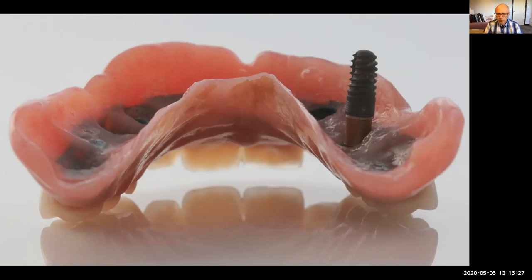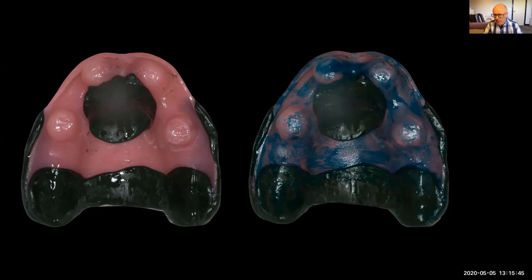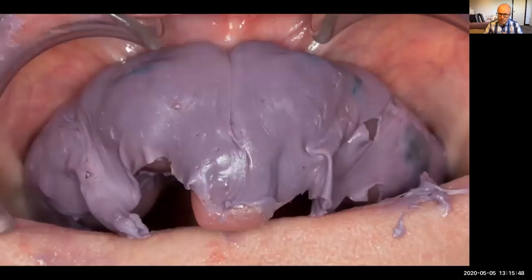But when I'm doing my impressions for the upper, say a definitive impression for the upper, I will extend it just like a complete denture and do all of my border molding as usual. And then I put my Impregum adhesive on, take this to the mouth and do all of my border molding as I would do normally. So pulling the cheek, both sides, making it narrow under the base of the nose, waggle the jaw for the coronoid process, and then suck my finger, forgetting the modiolus, to just trim around the edge of the denture there.